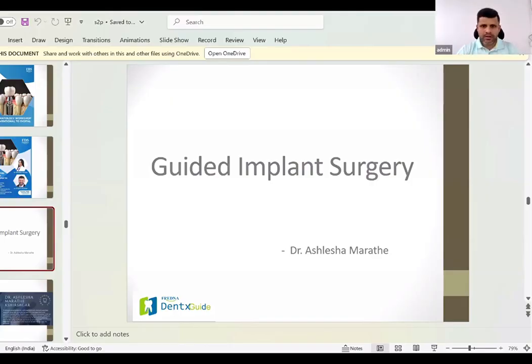Hello. Hello. Yes, sir. Yes. So I'll just read out the question. How come a canal in an extreme osteoporotic jaw cannot be traced completely? You cannot trace the complete canal in an osteoporotic jaw?